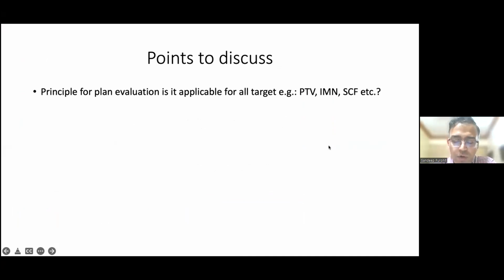So if there is no DIBH technique available, and we have to include all the lymph nodes also, right? So for such patients, we have seen that field in field and IMRT both techniques are applicable. If the doses to lung and heart are being evaluated, then IMRT is obviously better as compared to field in field or VMAT. But the only problem with IMRT is that the dose to the contralateral breast is somewhat larger as compared to field in field.